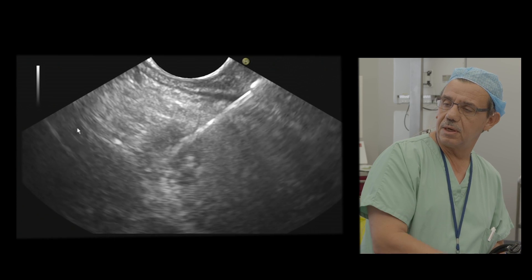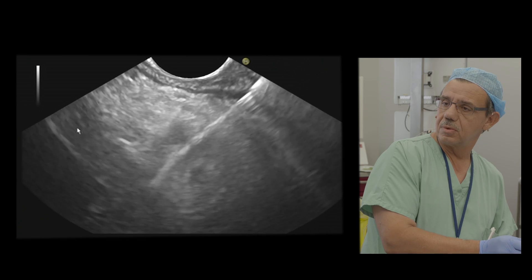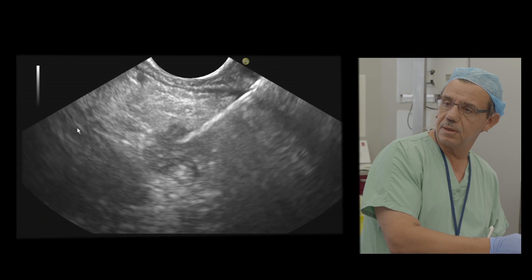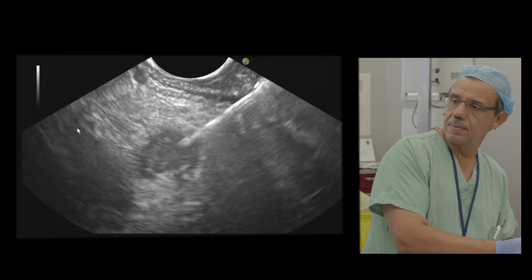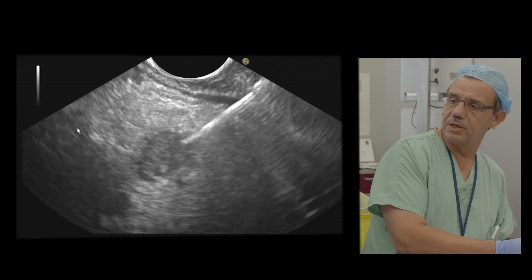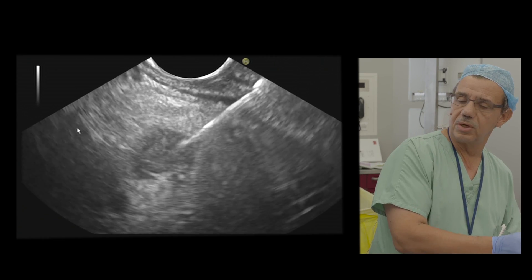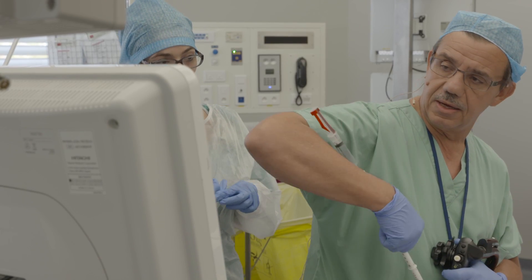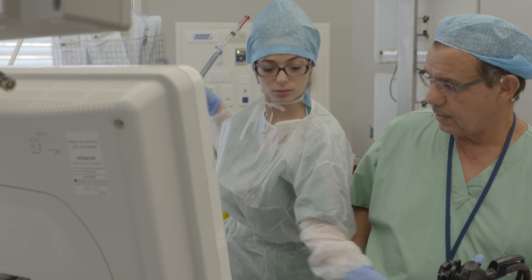Here you see very well the lesion. I think it's probably enough. Here you see very well the needle inside this small lesion. I think it's finished. We need only a good cytology for this small lesion.